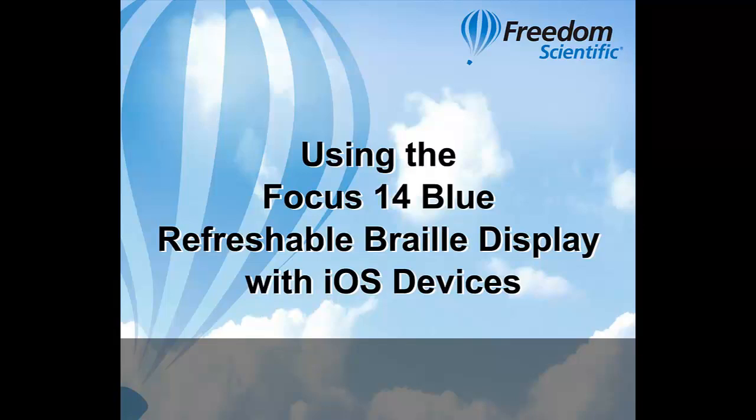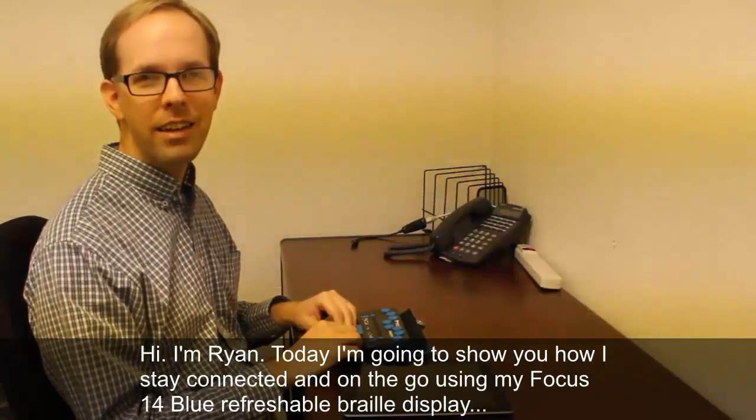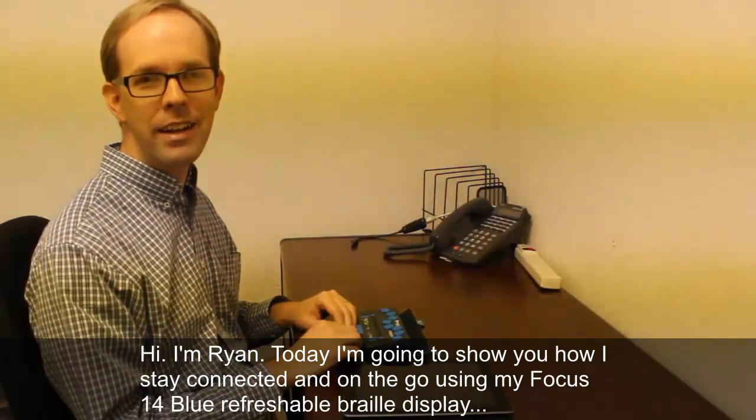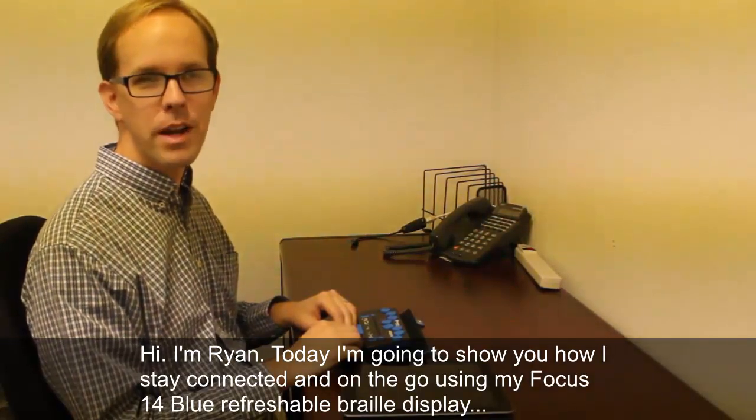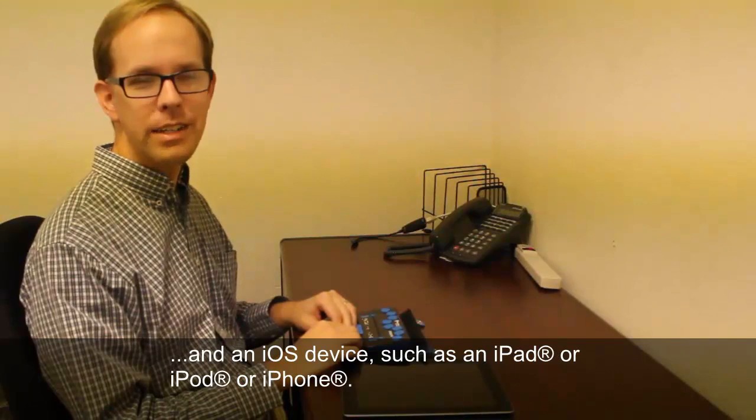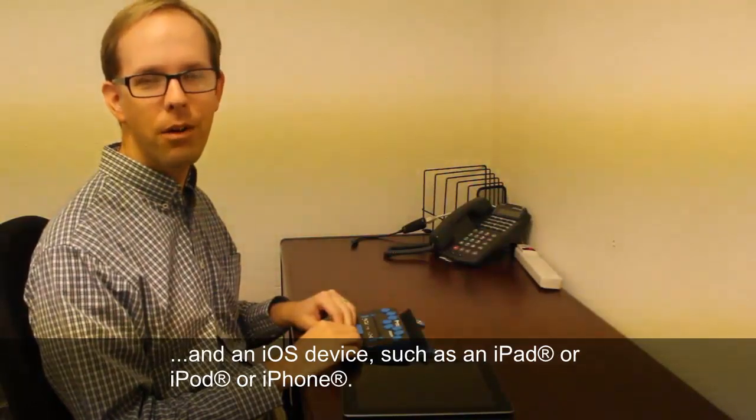Hi, I'm Ryan. Today I'm going to show you how I stay connected and on the go using my Focus 14 Blue Refreshable Braille Display with an iOS device such as an iPad, iPod, or iPhone.